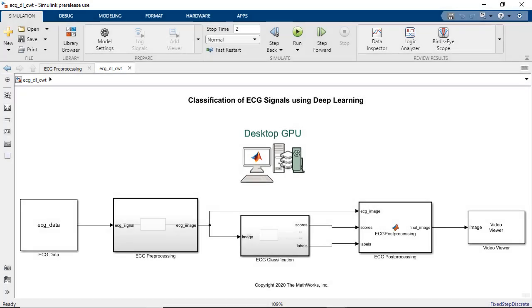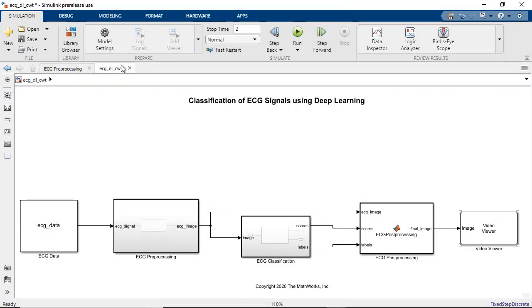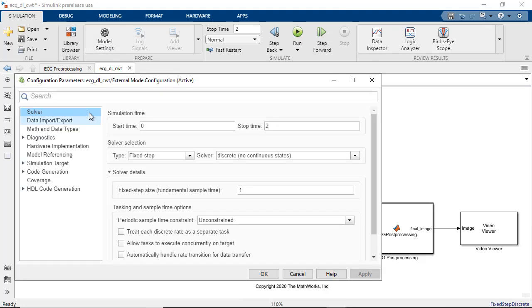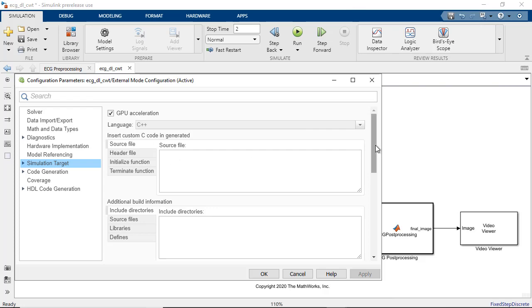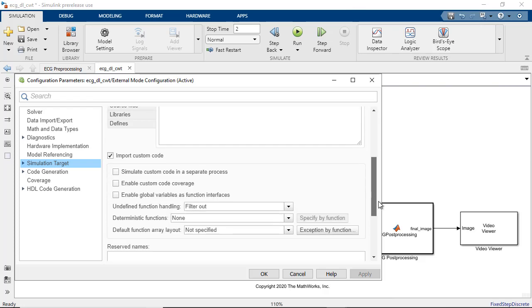We can use our desktop NVIDIA GPU to accelerate the simulation. In configuration settings, under simulation target, select the GPU acceleration checkbox and set the deep learning target library to cuDNN.